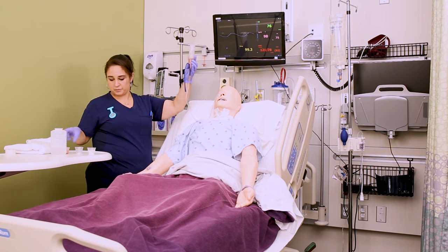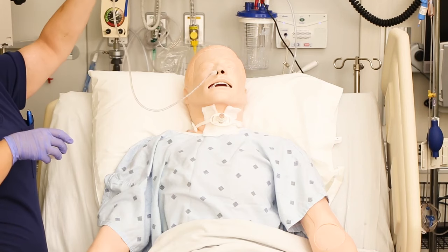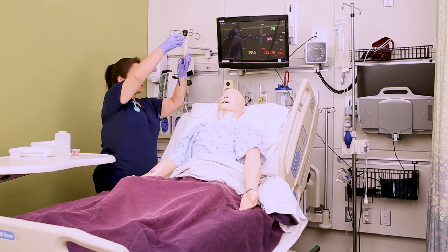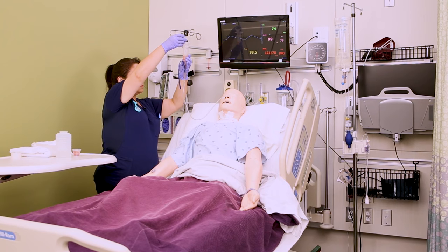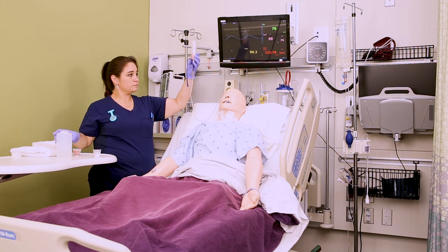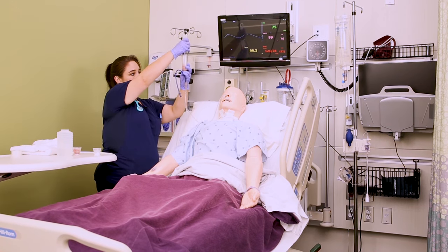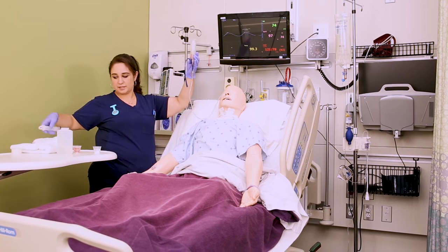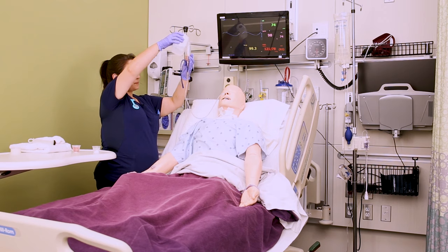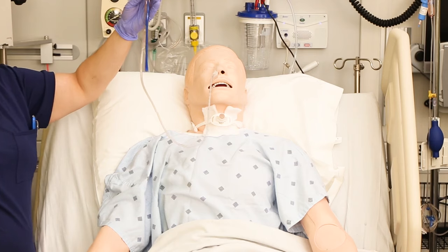Again, if you're finding some clumps, warmer water — obviously not hot water, but warmer water — can help dissolve those a little bit faster. Once that flush goes down, pour in the last medication and allow that to go in by gravity. I like the gravity method because you don't feel like you're constantly pushing and pulling — you can just pour things in one at a time. Sometimes you might need to use the plunger just to push it a little and get it going. Once that last medication is down, flush at the end with about 30 to 60 mils of water, typically in spurts of 20 or 30, to make sure everything gets flushed in nicely.